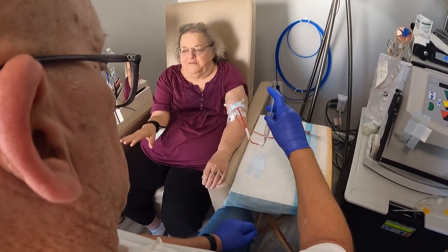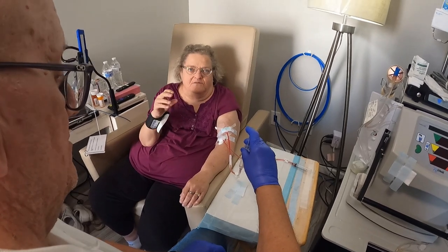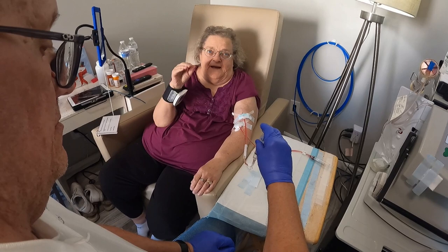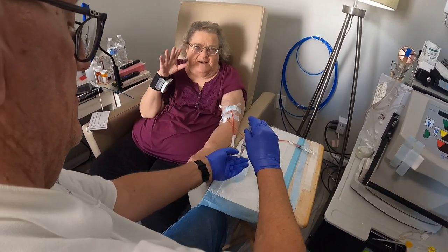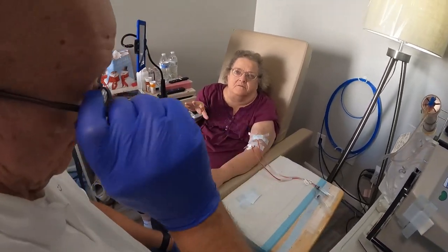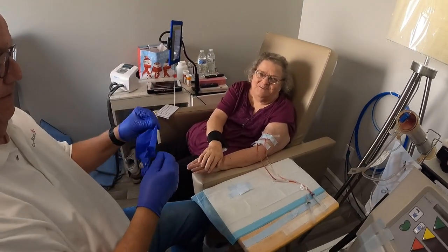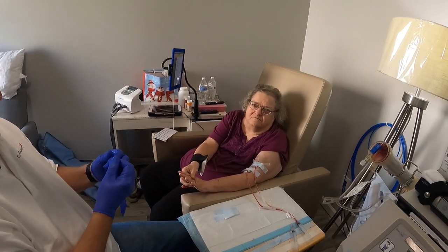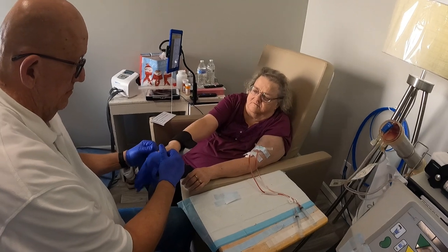If I weigh beforehand and it tells me that I need to pull off, everything's in kilos, half a kilo, we add the 300 plus these two. We add another half a kilo to that number so that we're not gaining weight. That's what I was going to ask. So what is your max? You can add fluid to your body, but how much can you add?